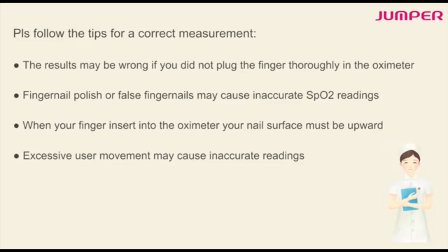When your finger is inserted into the oximeter, your nail surface must be facing upwards. Excessive user movement may cause an inaccurate reading.